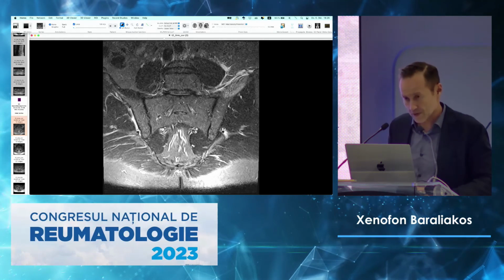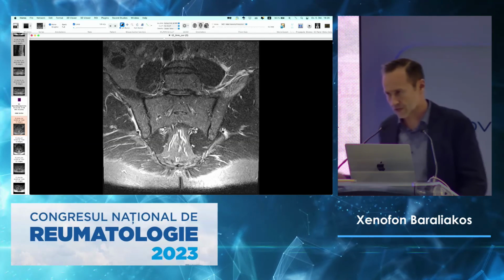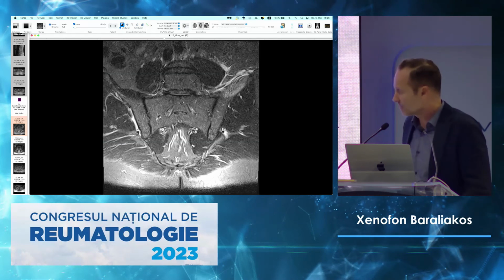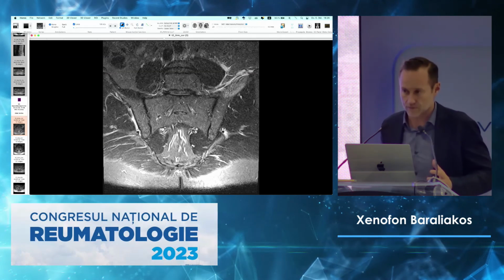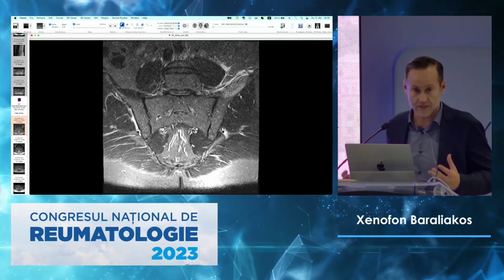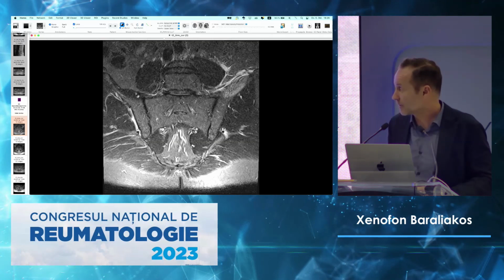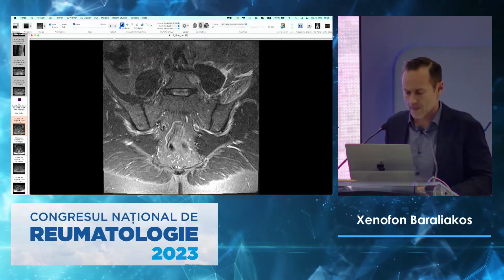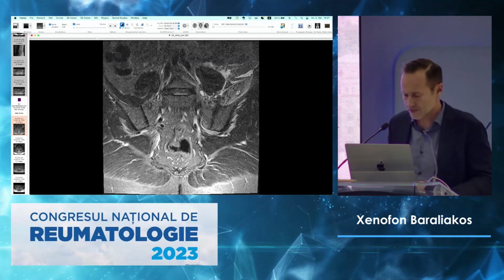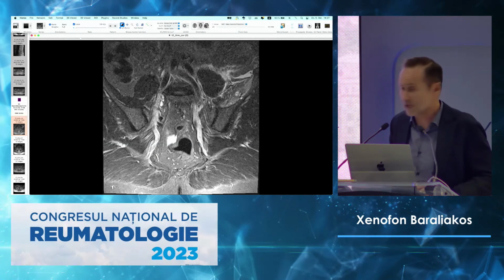The reason to show this MRI is that even in a patient with spondyloarthritis, let's say the diagnosis is correct, he came with a diagnosis, that's a different point whether you take it away or not, with high CRP, you always have to look around. The problem of that patient is that there is an asymmetry in this picture. And that asymmetry is here, that part and that part. So you see that although he has the disease, he may also have some other things, like that part here, which is all white with some white spots in it.